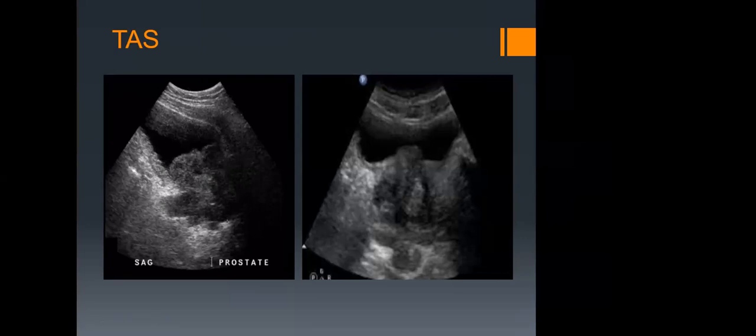Usually, I say, I'm not a pathologist. We are imaging technologists, sonographers, radiologists. It is only maybe the physician who is managing this patient or the pathologist who can confidently say, this is CA prostate. Many times, the physicians or the radiologists want to do a biopsy, even when we have shown confidently that there are high chances we are dealing with malignancy.